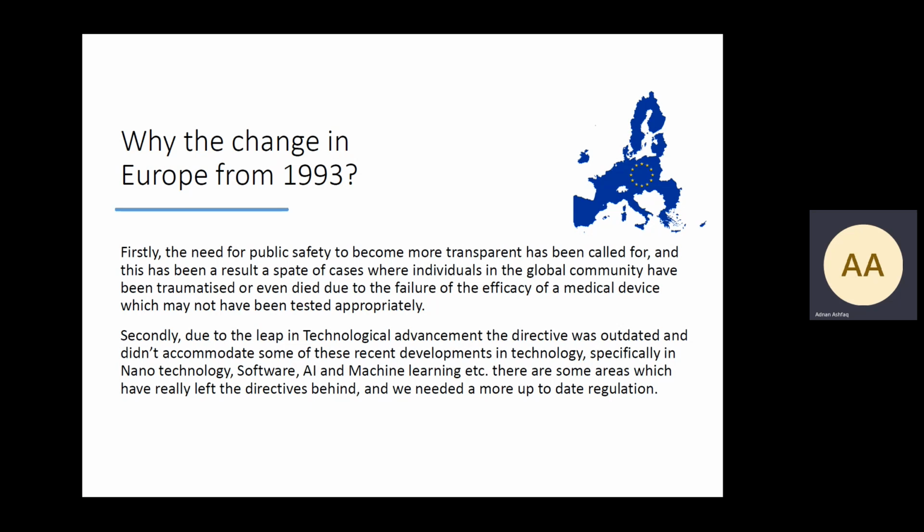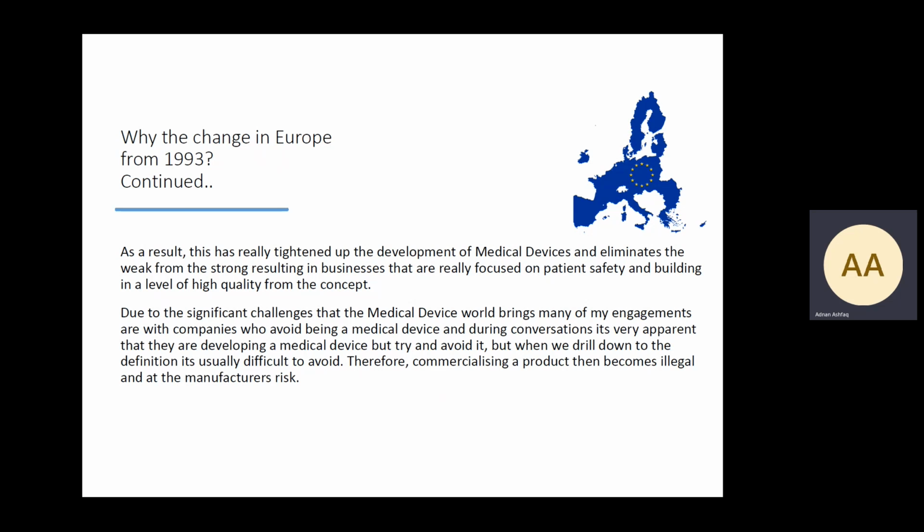Secondly, which is the point that I'm focusing on today, is due to the leap in technological advancement, the directive was then outdated and didn't accommodate some of these recent developments in technology, specifically in nanotechnology, software, artificial intelligence, and machine learning, etc. These are some areas where really the directives have been left behind, and we needed a much more up-to-date regulation.